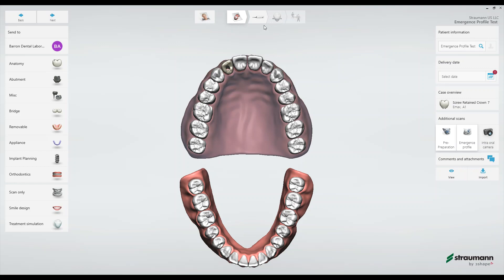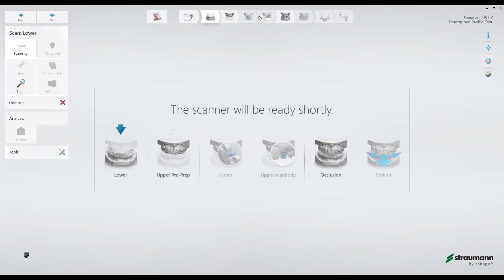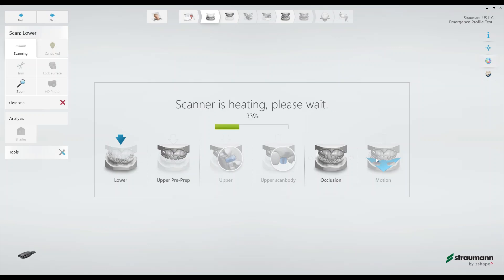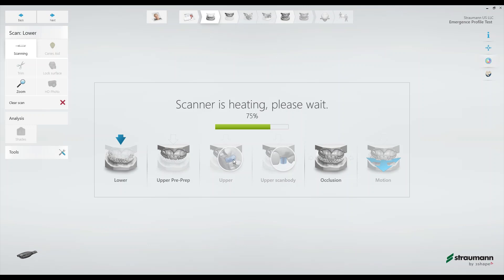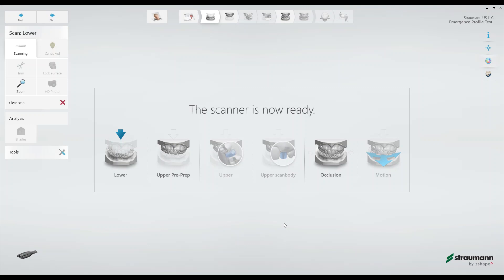Alright, so now let's go into the scan page. In this workflow you'll notice that there's five total scans excluding the patient specific motion. The order that we'll take these scans will be the lower, the upper pre-preparation with the healing abutment in, then the occlusion, then we'll come back and scan the upper emergence profile, and then the scan body. So let's go ahead and dive in.